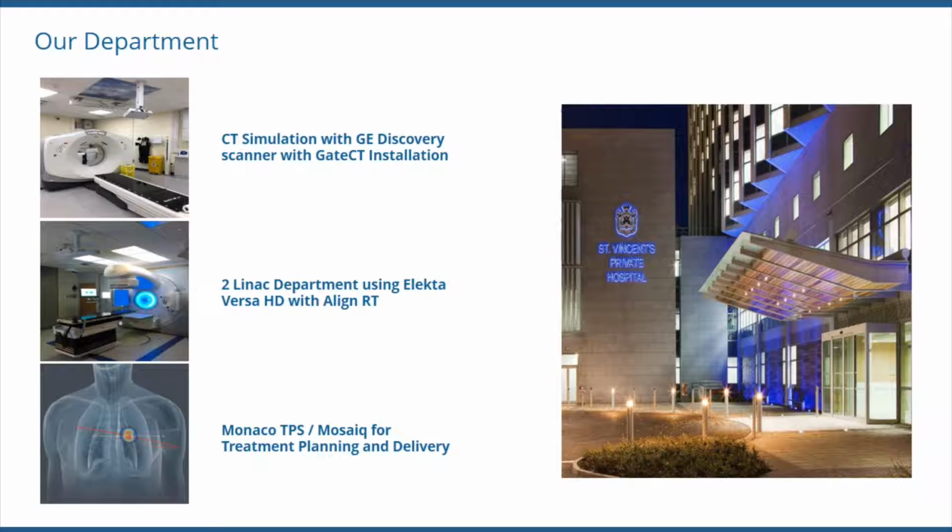Our department is a small department with 2 Elekta Versa HD linear accelerators. We have a dedicated GE Discovery CT scanner with gated CT for 4D CT acquisition, and we use Monaco and Mosaiq for treatment planning and plan delivery. We are a tattoo-less centre, meaning we rely on Align RT for initial setup for all treatment sites.